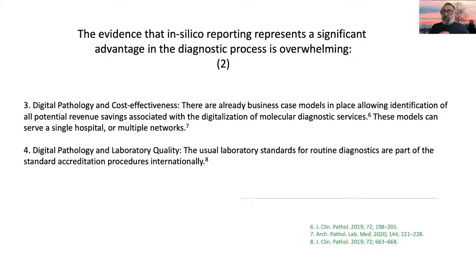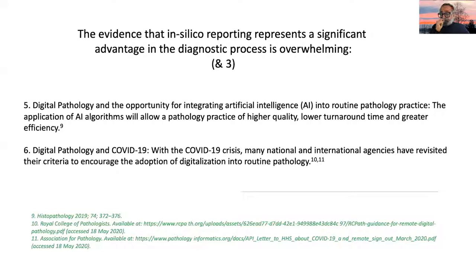In fact, many of our accreditations are now devoting a section on digitization. It is very important as well for cost effectiveness. We're beginning to see that a service that is run in a digitized environment is significantly more cost effective. And also very important, because we see that from the current COVID-19 crisis, being able to work remotely becomes an extraordinary enabler to be able to deliver pathology at many different levels and in many different ways.